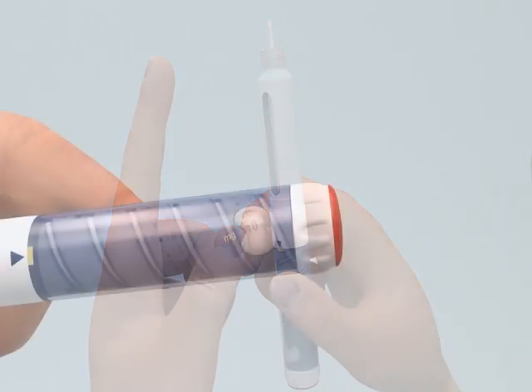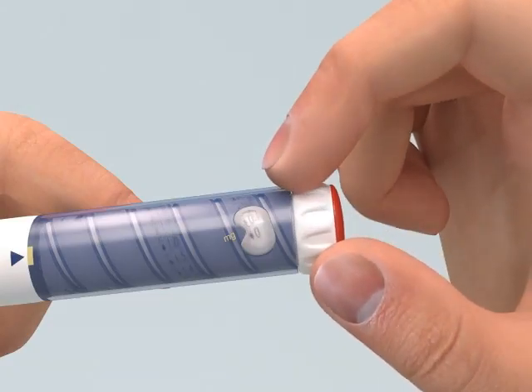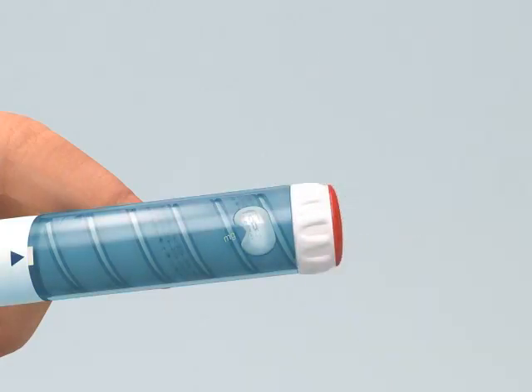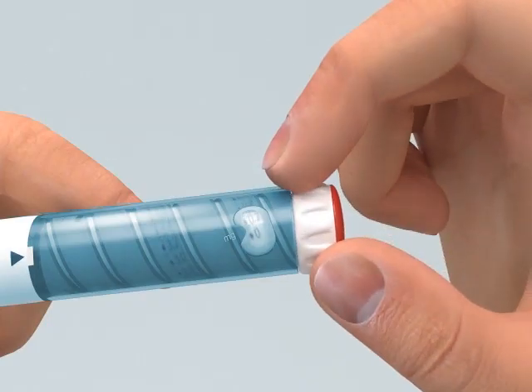If you are using the Omnitrope pen 5, set the dose 0.05 milligrams by turning the dose knob one click. If you are using the Omnitrope pen 10, set the dose 0.1 milligrams by turning the dose knob one click.